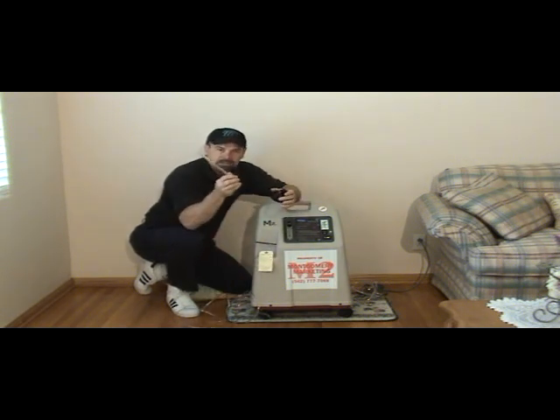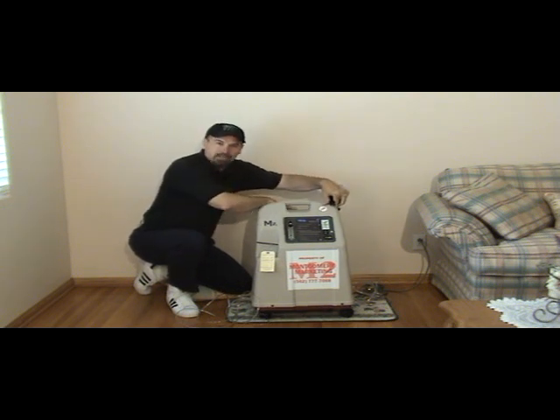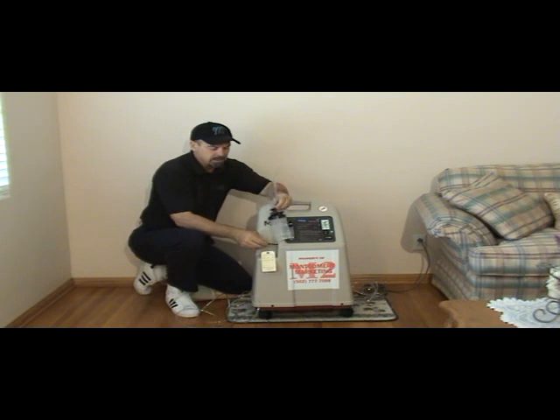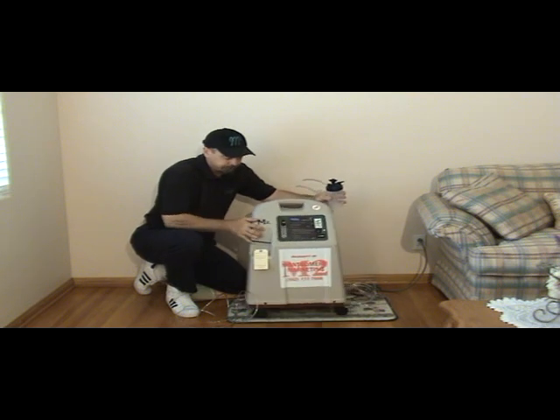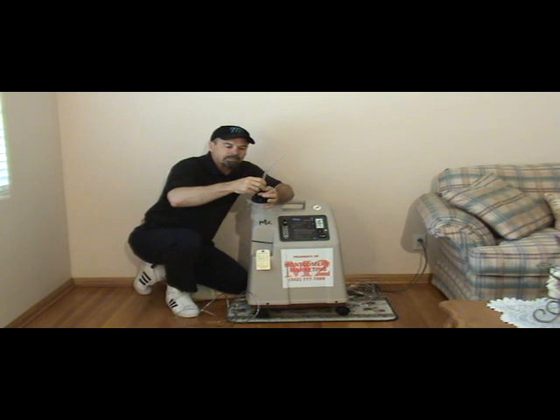Then you take this length of tubing, and by the way, sometimes this length of tubing, if it's not put on the back because they're not using it right at that time, or if it's not hooked to the bottle, will be in a compartment here on the side of the concentrator. You can open that up with a coin or with a screwdriver, and sometimes it'll be sitting in there. So you take the black connector, you hook it to the top, and you screw it on, making sure that it's tight.